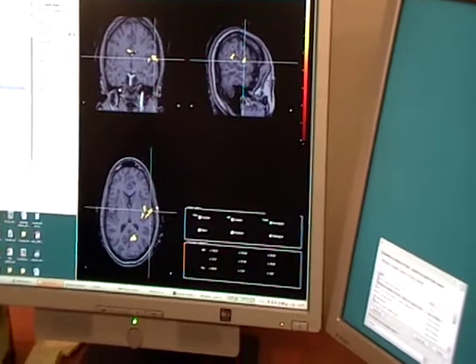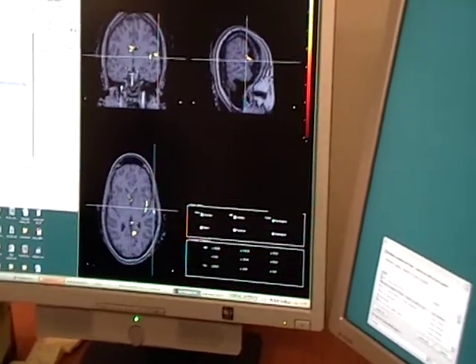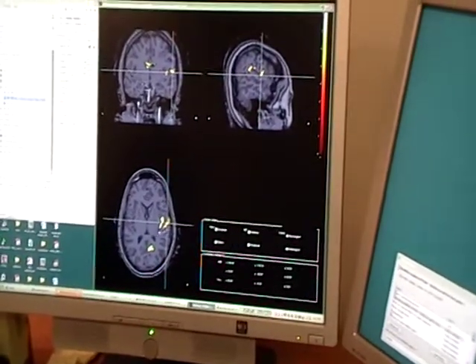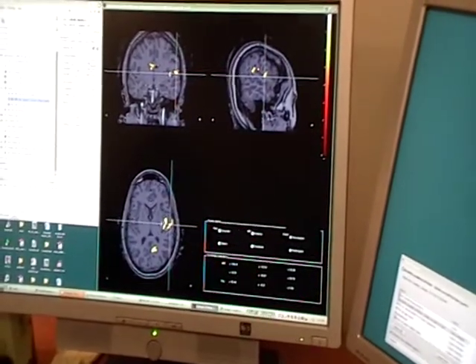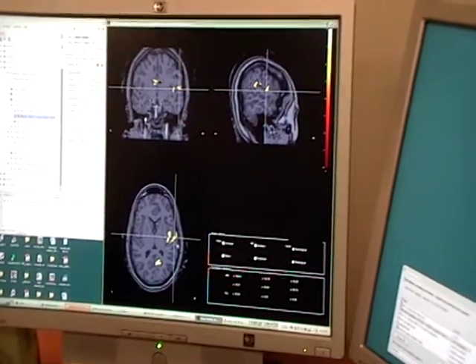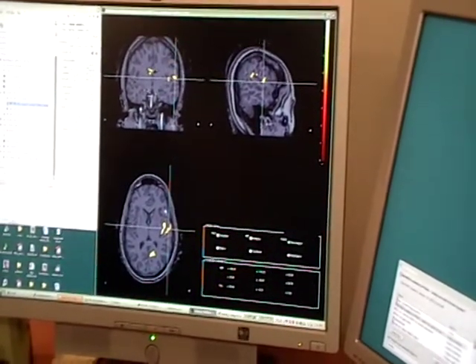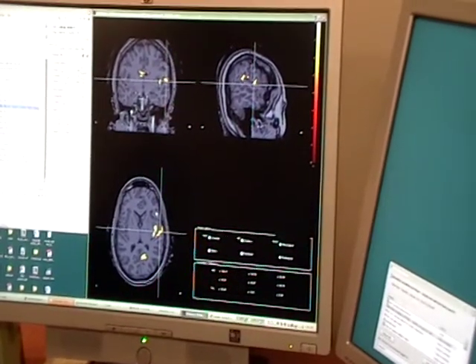And he can also then put the coordinates of where her movement is also, right? Because that's a big deal too, to know where that is. Exactly. It's exactly what we've seen before. In the 3D image, you can contrast this epileptic activity with the healthy and normal brain functions like we've seen before in different colors, and therefore the surgeon can make sure that the risk of impairing crucial brain function is really minimized.